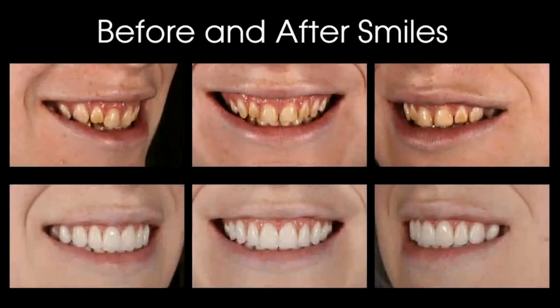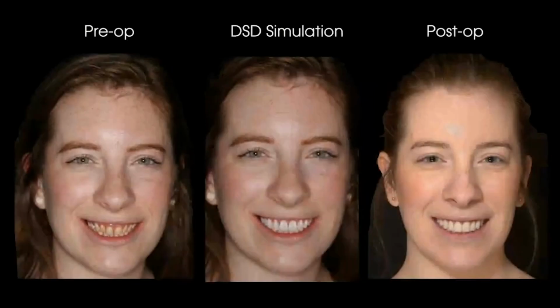And here are her before and after smiles. So she's no longer got the stubby teeth that tip backwards that are gummy, and she's actually got a pretty nice smile. So here is the pre-op, the digital smile design simulation, and the post-op. And you can see that we ended up with a result that's pretty close to what we wanted there.